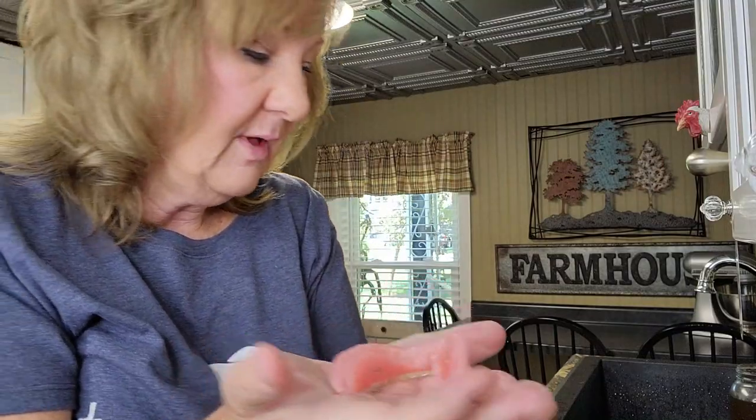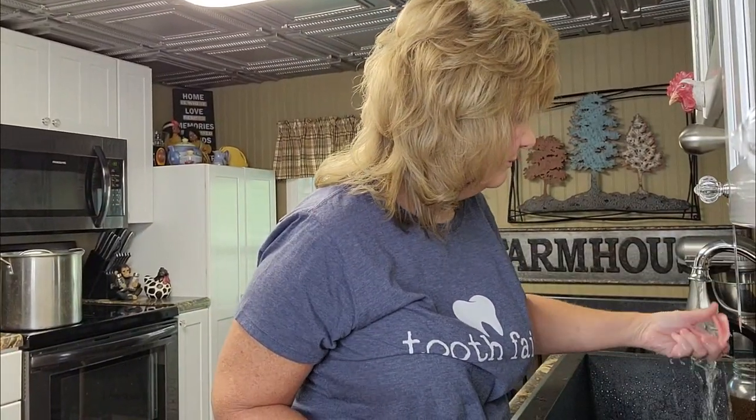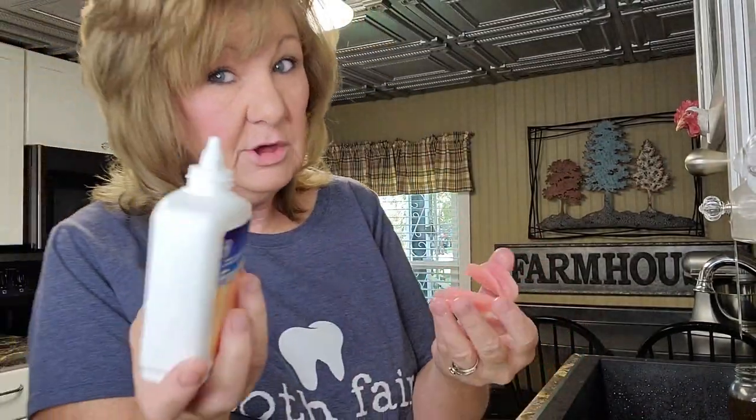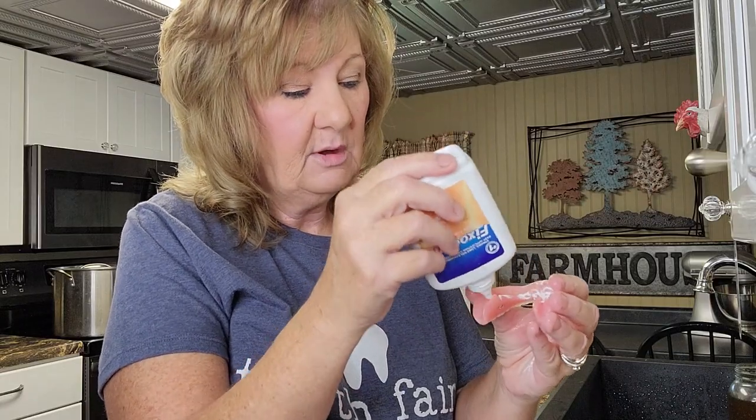Let me show you how I put my bottom teeth in so they don't fall out. I promise you I have worn them all day, gone to the Olive Garden to eat dinner, and they stayed in my mouth — I'm so happy about that. I'm going to wet my lower denture a little bit. I have this Fixadent powder. I use this first and just sprinkle some in there.